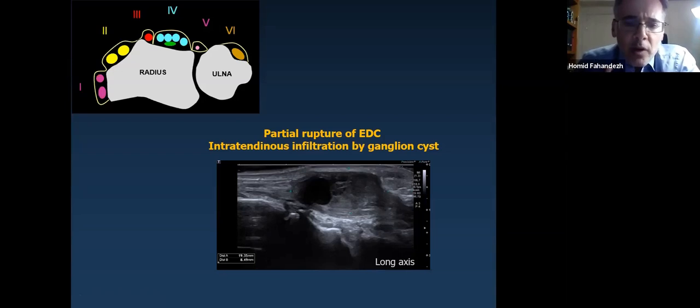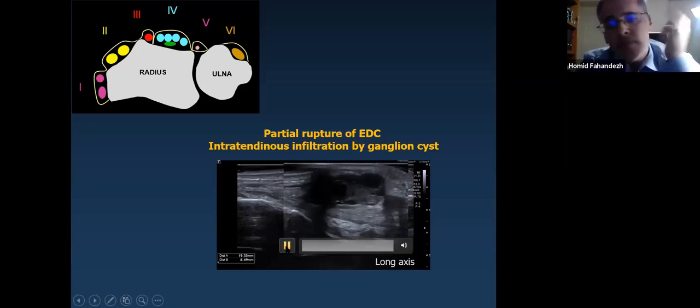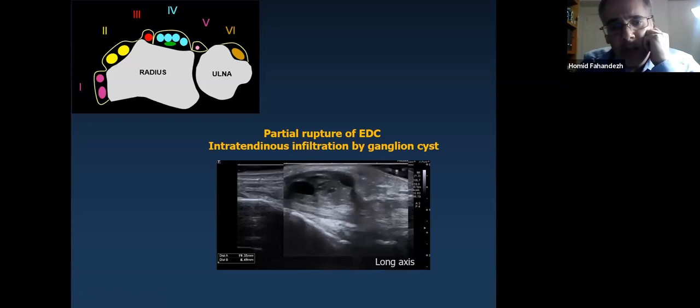So you have to ask the patient to move, and clinically you can check the extension and flexion of the fingers, but then you can see with the ultrasound, asking this, how the tendon is moving, and even with the infiltration, the tendon works.